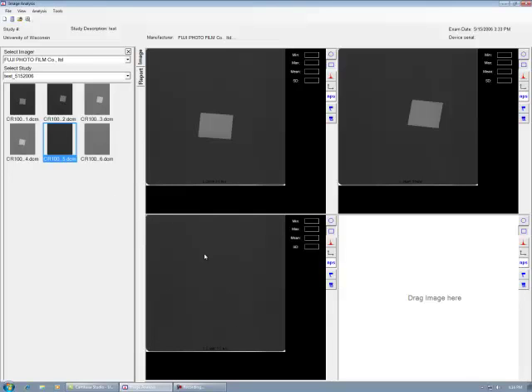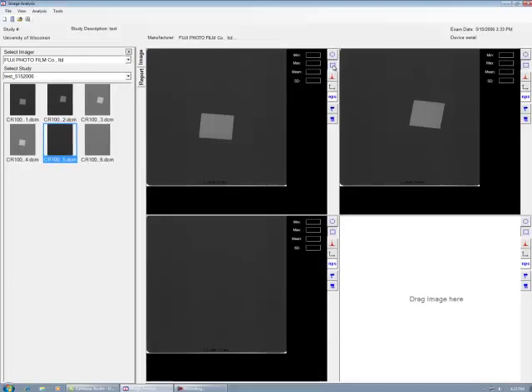Next, we will select a region of interest for the analysis. This is easily done with the cursor. Select the ROI shape on the right of the image. Then place the cursor in the area where you are interested in measuring and press the left button. Drag the resulting box until it covers the area of interest. Repeat this in each of the other images.